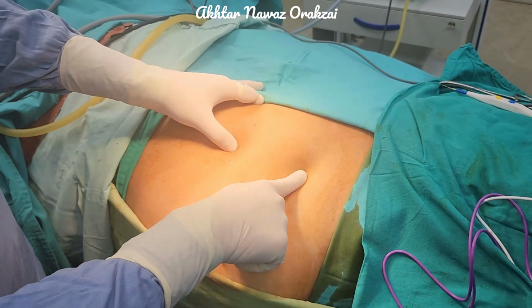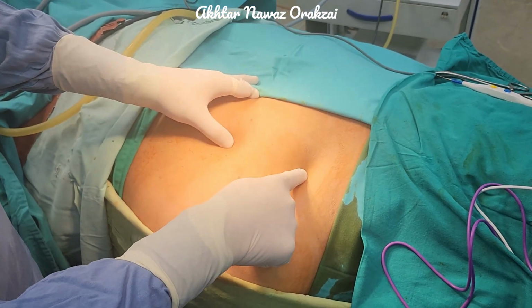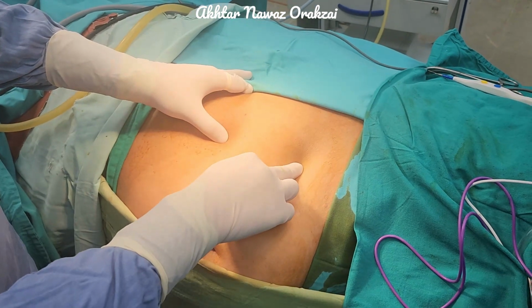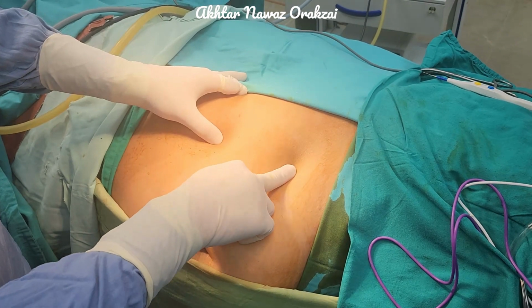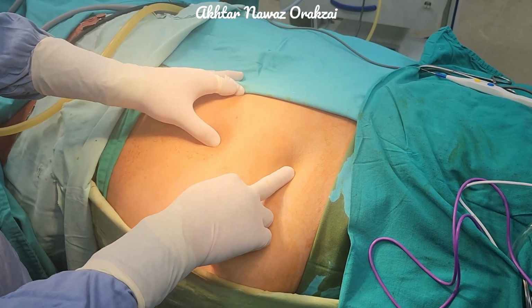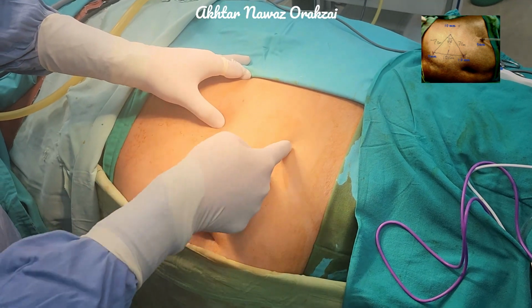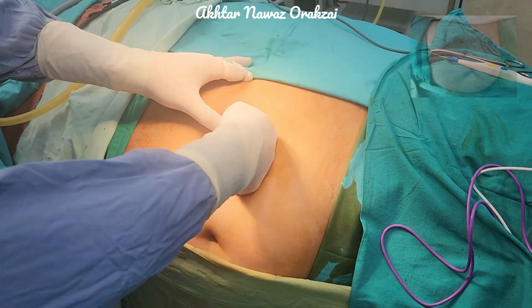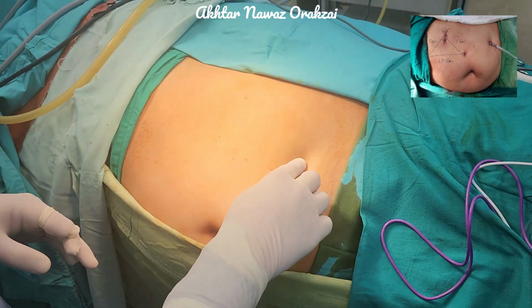So we create pneumoperitoneum through this port, and then we put in an assistant port which will help us lift the kidney for retraction. And second thing is that we can use a suction here, and by the end of the procedure we will put in a drain here. So this will be another triangle of the same size. So now we create the pneumoperitoneum.